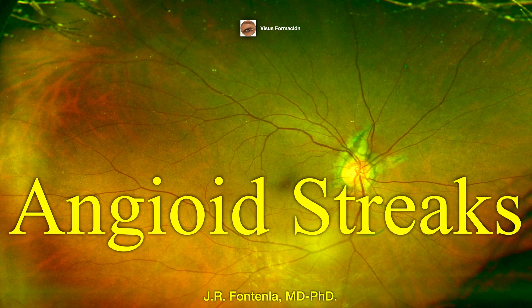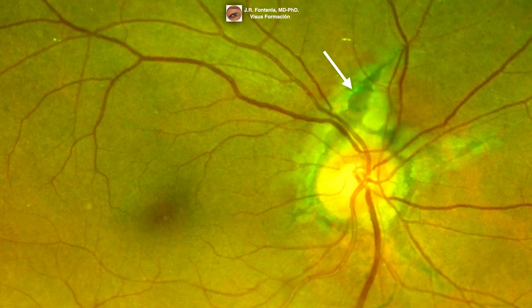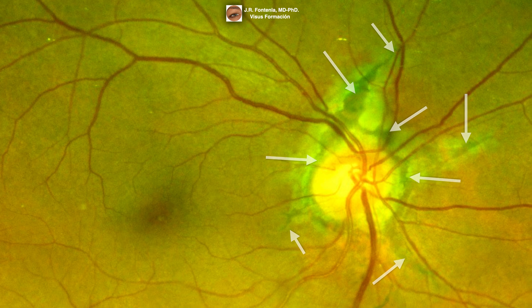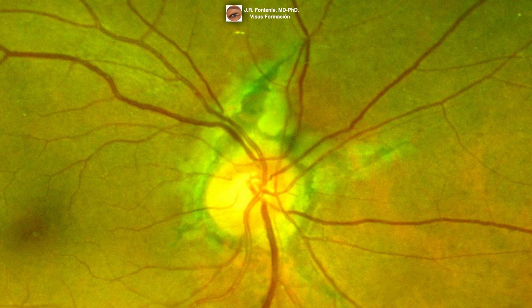Angioid streaks are breaks in the degenerated Bruch's membrane, which typically form around the optic disc and radiate from it, as we can see in this image. These breaks have a linear appearance and resemble blood vessels, which is why they are called angioid streaks. In fact, angioid streaks can be confused for retinal blood vessels on superficial examination.